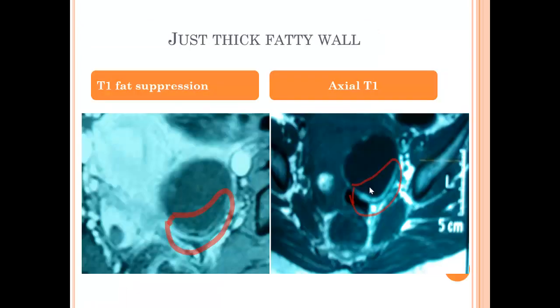Another case of bilateral teratoma: one side shows a fat ball inside that is suppressed on fat suppression. On the other side, the left, there is only a thickened bright wall on T1 that is also suppressed on fat suppression — the only sign here is just a thickened fatty wall.